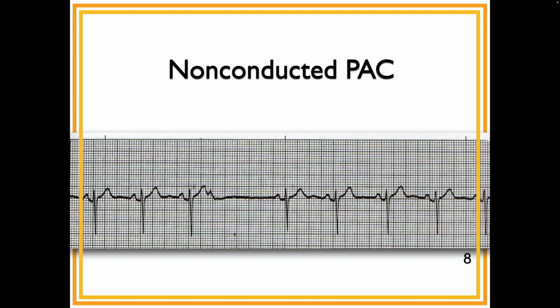But I think most likely, you're right, it would conduct back up, and if it's in the middle, it would go down and go up at the same time. Which means that the atria around the SA node are depolarized. So it's very possible that the SA node actually fires here, but because the atria are refractory at that point, you don't see a P wave or a QRS. It just dies in the SA node.